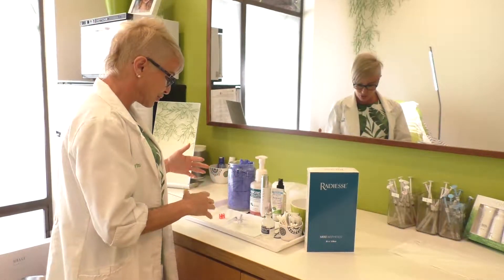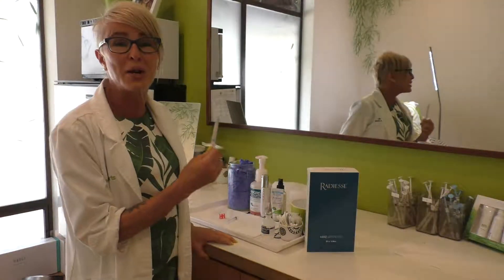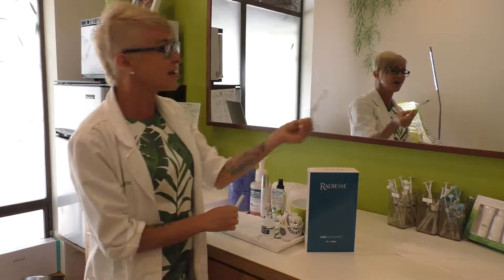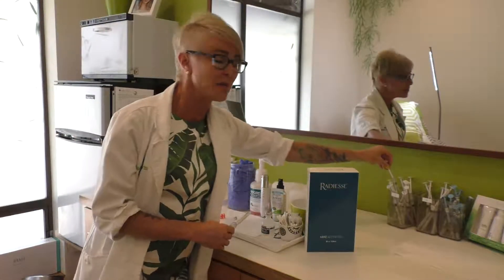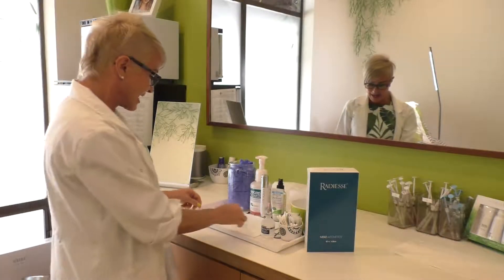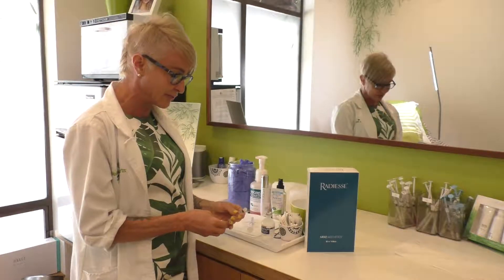Let me show you what's so neat about it and where you can use it in the face. It comes in a syringe of 1.5mls — many other syringes come as 0.8ml or 1ml — so first of all, you get more product right off the bat. It also has a lot of versatility in how you use it.